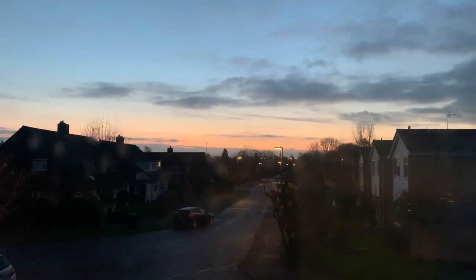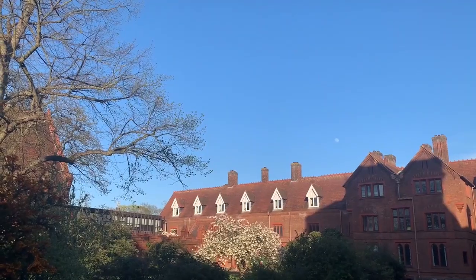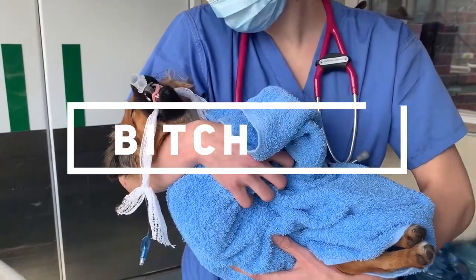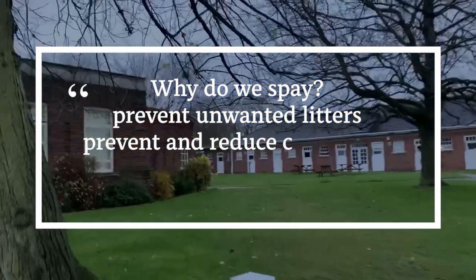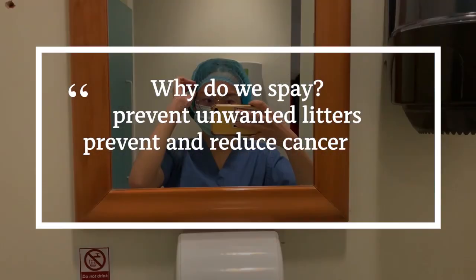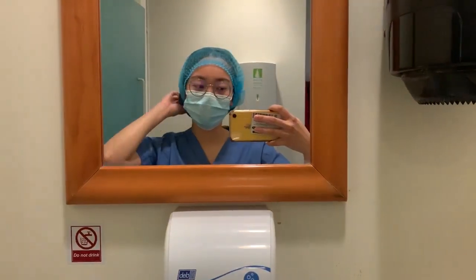Hey friends, Mei here. Today I'll bring you through a routine surgery we carry out in female dogs called a bitch spay. We spay dogs to prevent unwanted litters and also prevent other diseases such as pyometrias, ovarian and uterine cancers later in their lives. So let's begin!